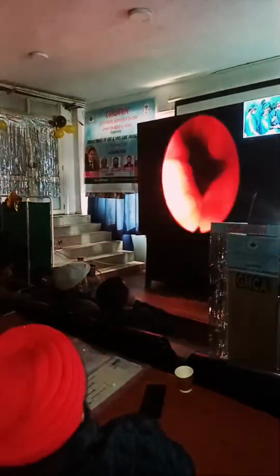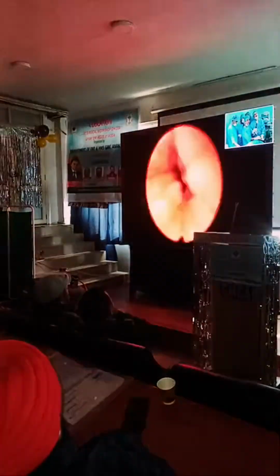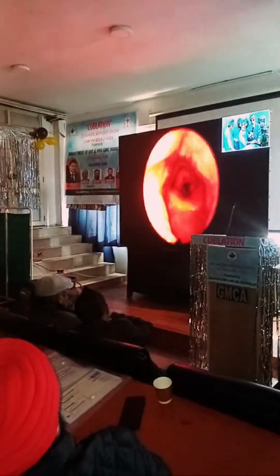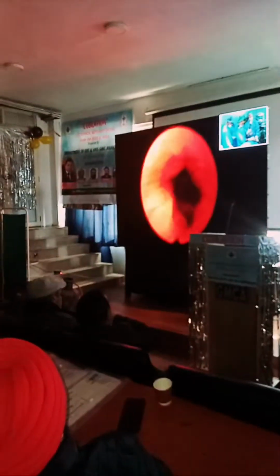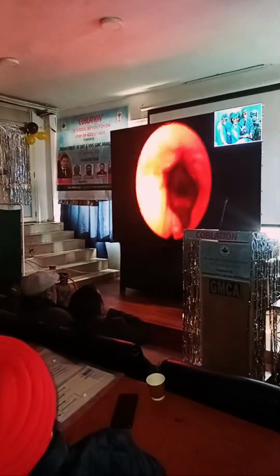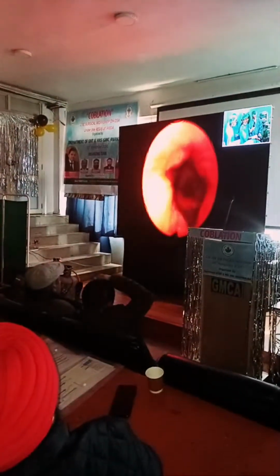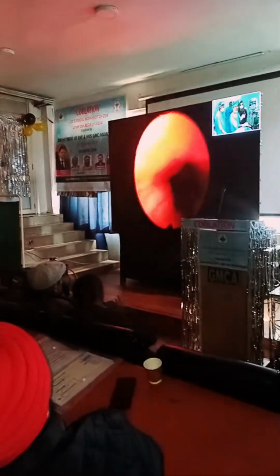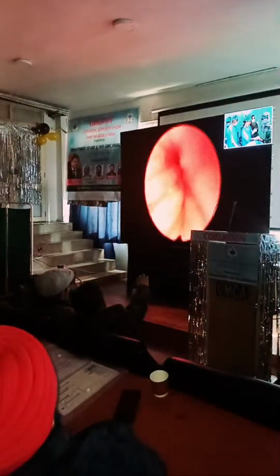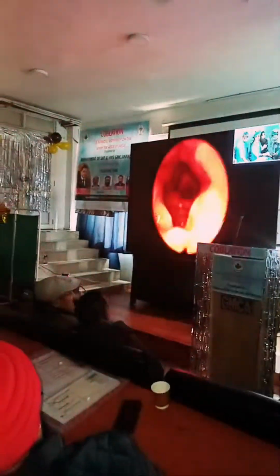Now you see his problem seems to be majorly in the soft palate. But we'll wait for him to start snoring and go into apnea. I want to see at least one apnea. It's the lower part of the soft palate, so it's a great candidate for palatal surgery. It's okay, right now it is 93. His lowest is 62, so don't worry. He's still not sleeping. Don't wake him up.